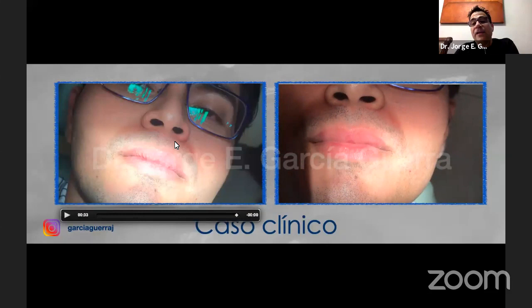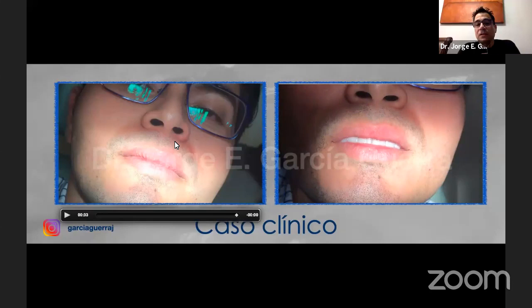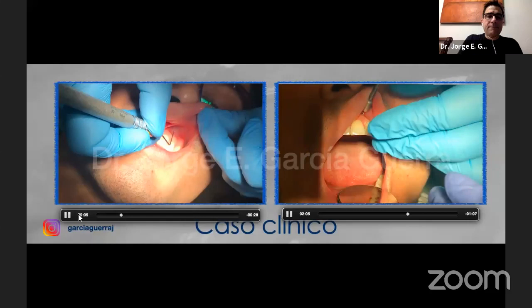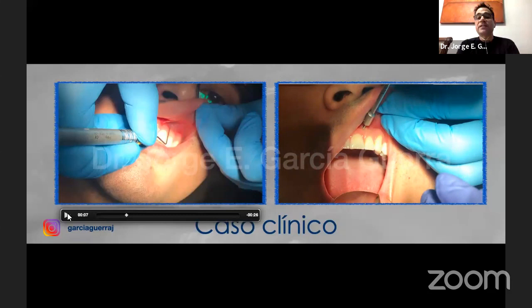As I showed you in the past lecture, I like to use a very big mirror when we're putting in the mini implant, so we can visualize where the roots are and do the correct insertion. Let me just advance this one. Okay. So you can see how we're inserting the mini implant there between the roots. I have my assistant helping me with this mirror, so I can see exactly how we're going to position that between the roots. It's going to be very easy to do.